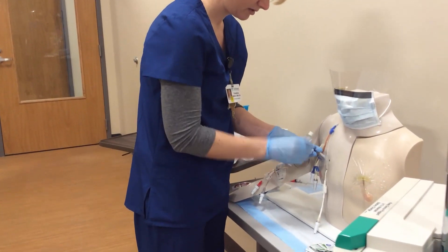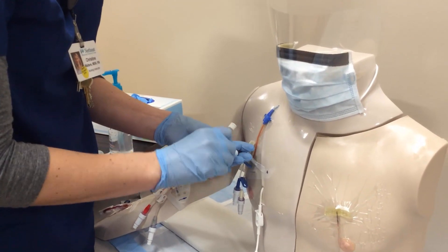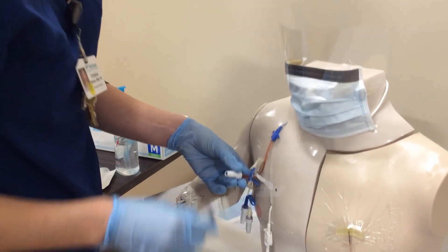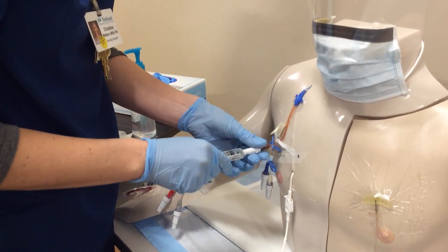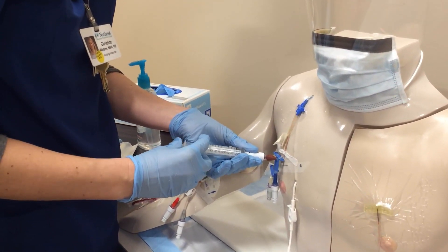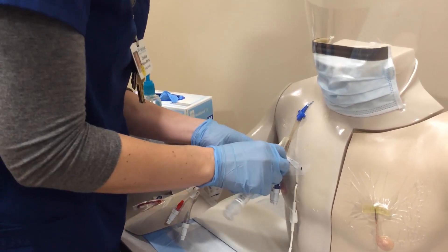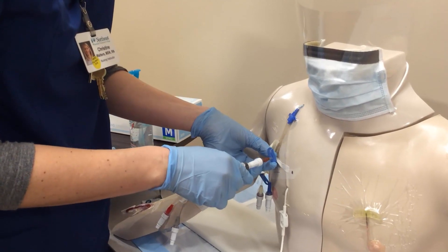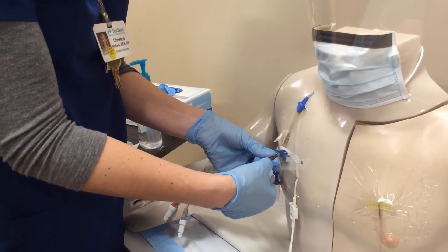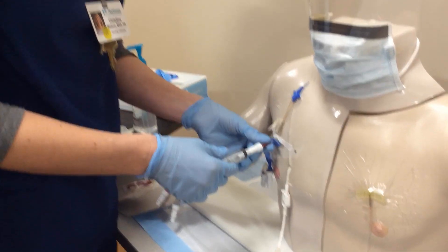I'll grab my alcohol swab and clean off the end of that port really well. Now I need my 10ml syringe with 3cc's of normal saline to flush this line. I'll take the cap off, connect my 3ml of saline, open up the line, and pulse flush to create turbulence in the line to push through anything that could be in the tube. I'm going to clamp my line again — every time you take anything away you want to clamp your line, because if the end cap comes off it helps prevent air embolism.